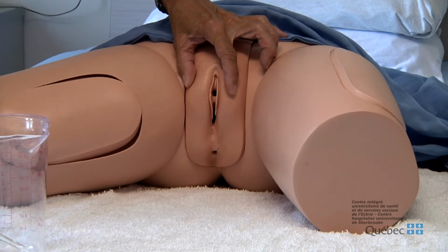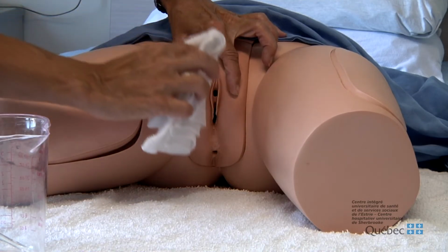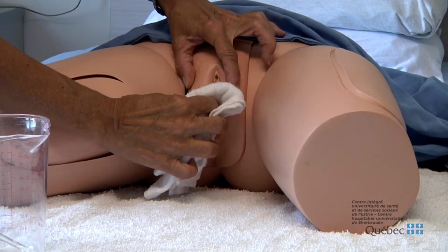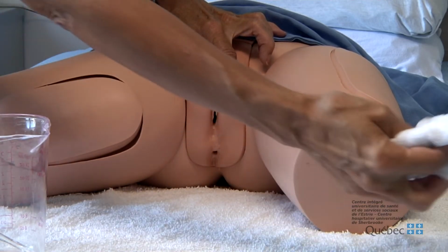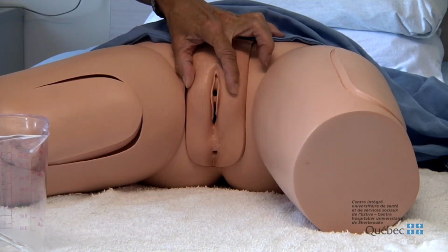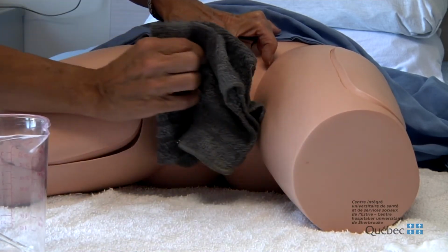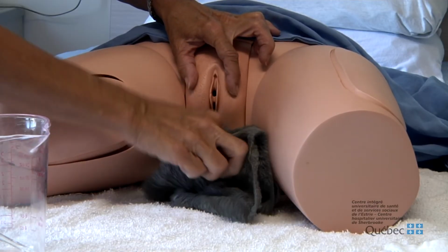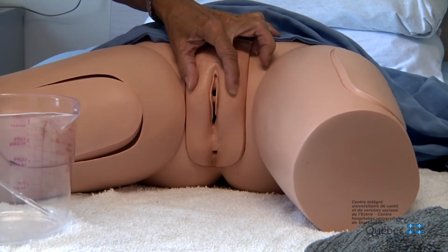While keeping your outer lips separated with one hand, use the other to clean the area around the urinary meatus from front to back with the soapy washcloth. Use the damp washcloth, the one without soap, to rinse the area around the urinary meatus from front to back, and set the washcloth aside. Make sure the measuring cup is within easy reach.